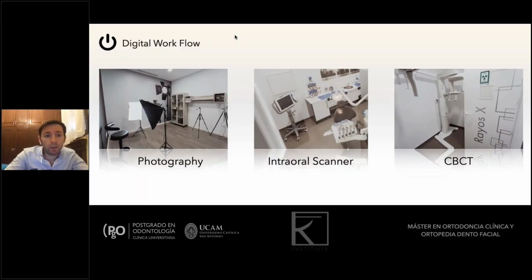So starting, I have to say that nowadays there are three important things, because all of our diagnosis, depending on the media that we have in our office, is going to depend on the quality of the photograph, the quality of the intraoral scanner, and for sure the quality of the CBCT.